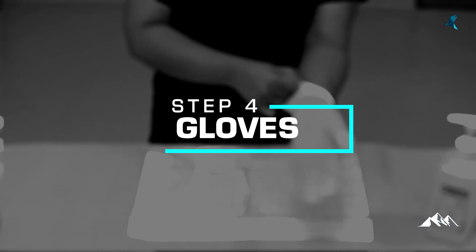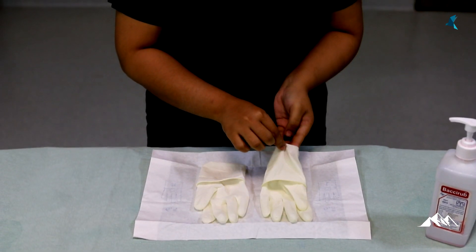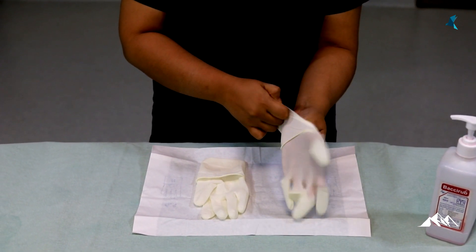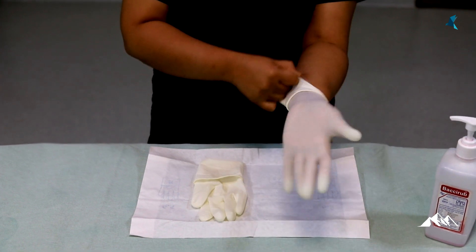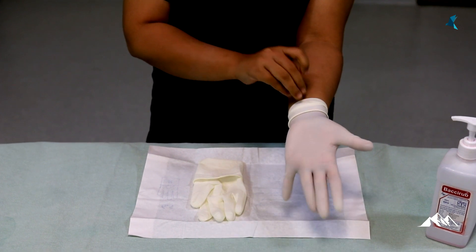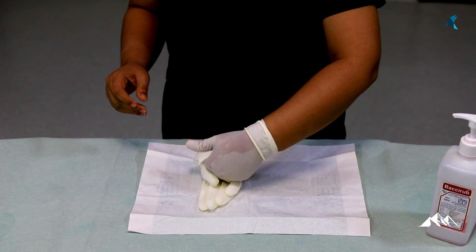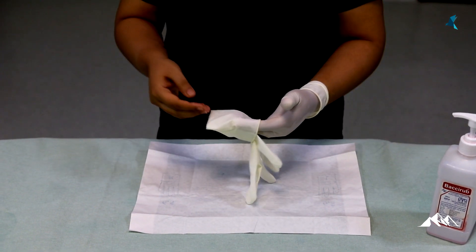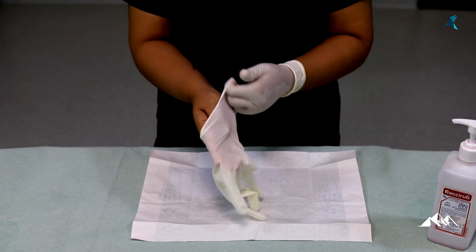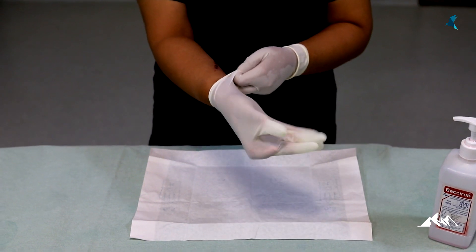Step 4: before we proceed with gloving, we have to repeat hand hygiene, as the last step performed was putting on the shoe covers. Step 5: donning the first pair of gloves. Carefully take the first glove by holding at the inner side and put it on. The second glove is taken by holding at the outer side using the gloved first hand. It is important to extend the glove up to forearm level for better protection. For individuals who are allergic to latex gloves, an alternative like nitrile gloves should be available.